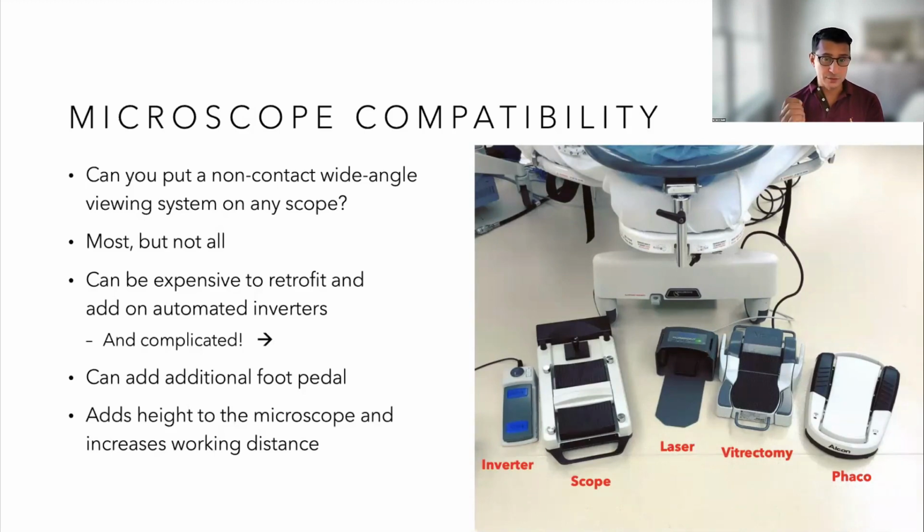Here's an example. I used to operate at a surgery center before I moved into my office for surgery. Here's a typical combined case, anterior and posterior segment, that I would have to have set up for me, or sometimes rearrange the pedals myself because it was so complicated for the staff. But look at this. This is 5 different pedals. Obviously one for phaco, one for vitrectomy, sure.